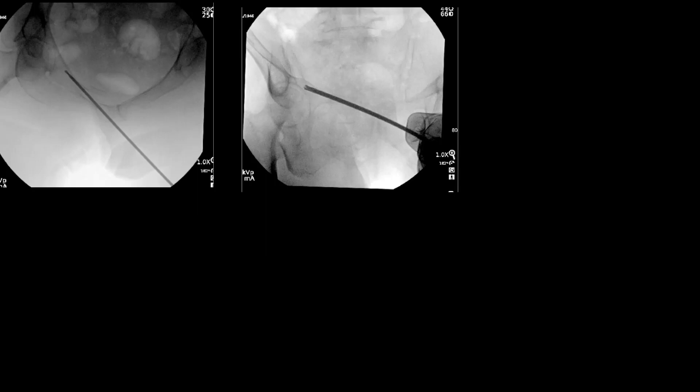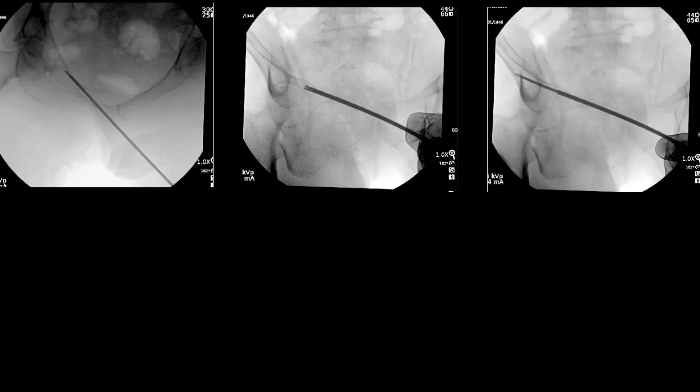The advantage of the Luminos is that even if you're carving out more bone when you use this technique to reorient the wire, the implant is going to fill the space to its maximum capacity — it's going to fill and occupy the space. I think that's one advantage of using this implant in this population where the bones are essentially hollow tubes. Once you're satisfied with the orientation, you can tap the guide wire down the rest of the way.